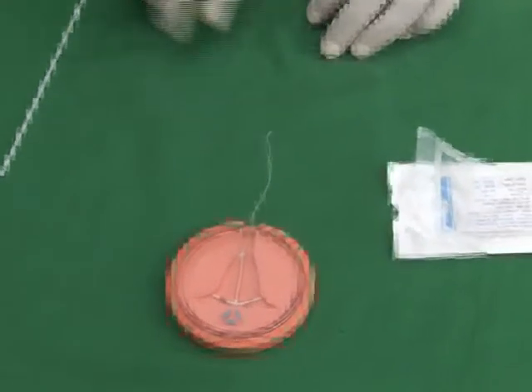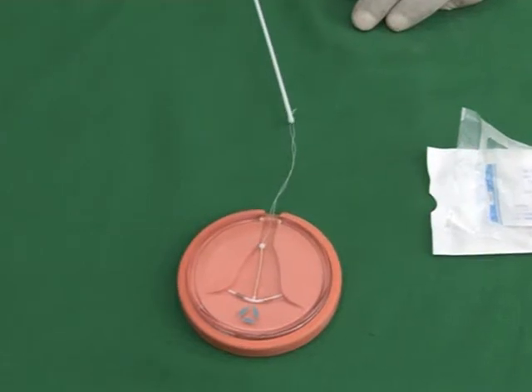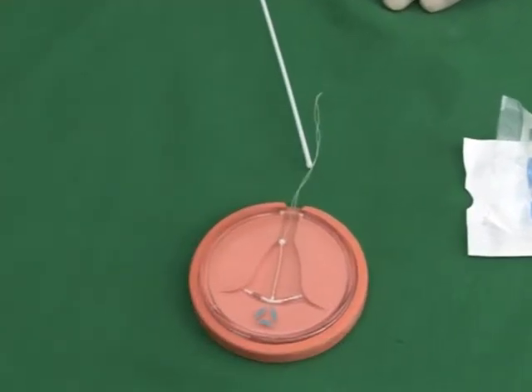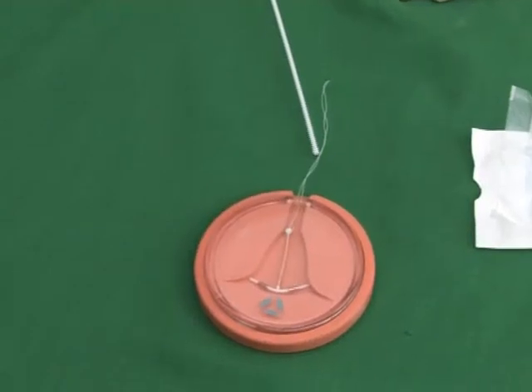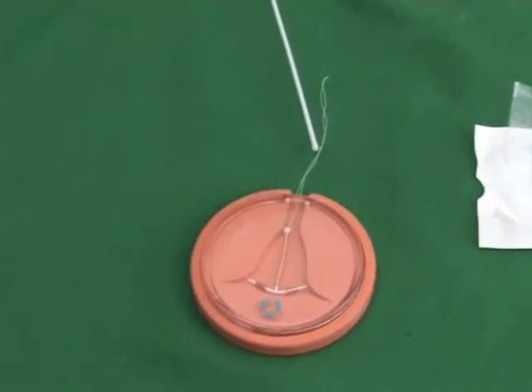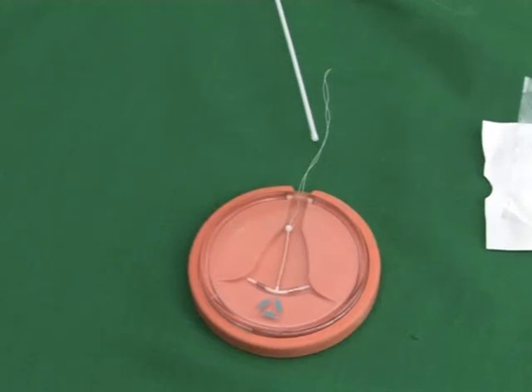The length of the thread can be cut about 3 to 4 centimeters below the cervix. This will help the patient to check the presence of the intrauterine device regularly by palpating the threads.